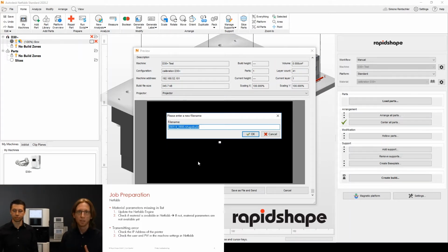Maybe just one additional hint or a recommendation. What you can see here is the file name, which is per default the date and the time. So that would be the 14th of May, 9 AM, 8 minutes, and .r-shape build. If you want to make a change here, you can do that, but please make sure that you just change the file name. Do not delete or change something with the file type at the end. If you do any change here, the file might be transferred, but the machine cannot recognize this as a print job, and therefore it will not appear on the job list when you press the button select job on your printer. All right, I think this is quite easy to understand.